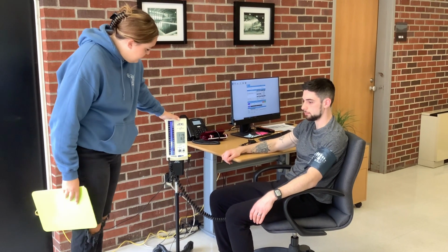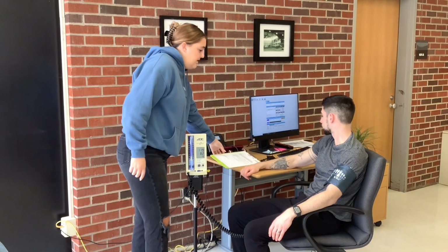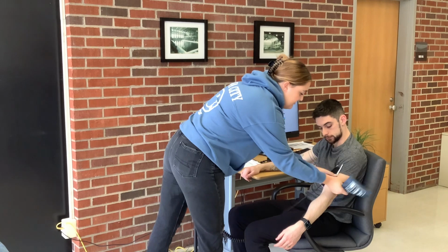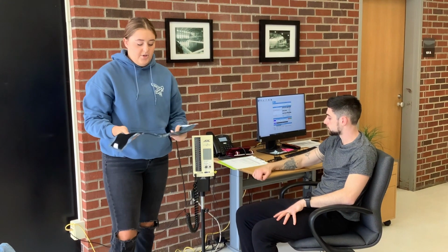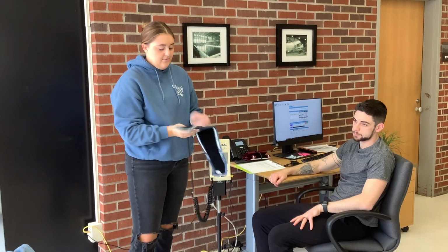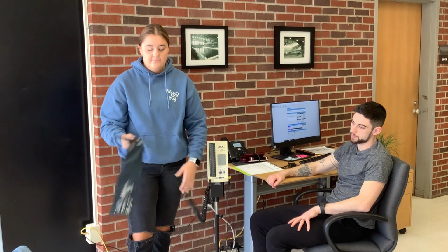So Ryan's numbers look nice and healthy. He has 119 over 82 and then 76 beats per minute. So you would go ahead and record that. And then when you're done, you just take this off. And then I usually wait until after the appointment, and you just want to make sure that you wipe down both sides of the blood pressure cuff, and then I go ahead and wipe down the cord as well. And that's it.